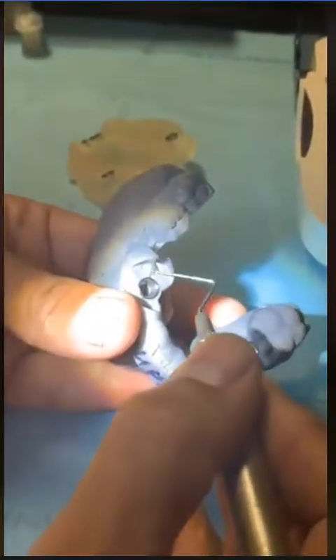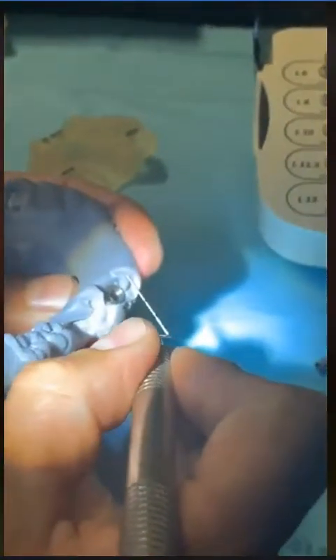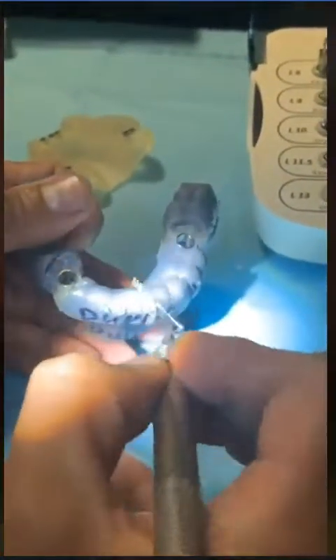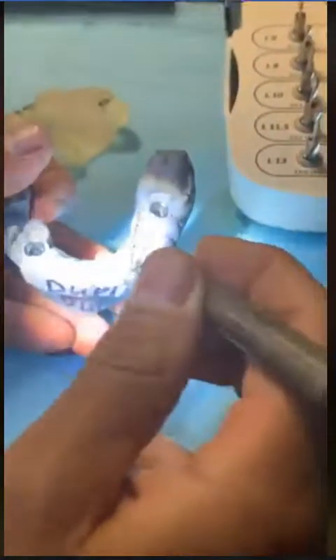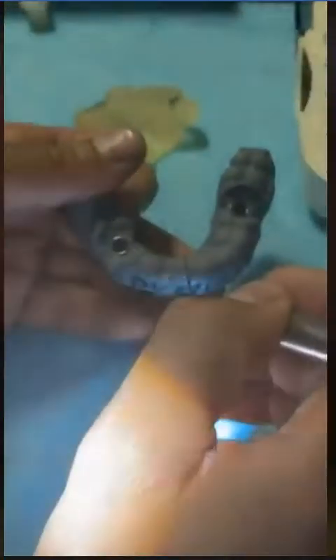So here, let me show you on this side. You see, this side is also, look at this, this is a canine, and take a look. There is really no space. Now, generally speaking, I also open up another one here because the distance from one side to the other is very great. I open up another area to make sure that the anterior area is also seating well and properly. So you have multiple locations to make sure that your guide is accurate and seating well. Okay? Anybody has questions?